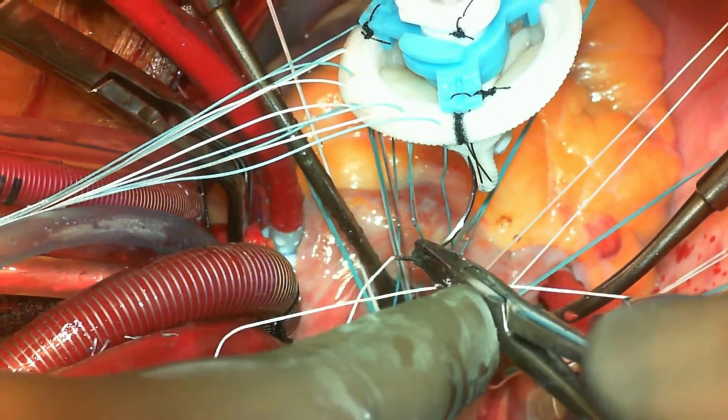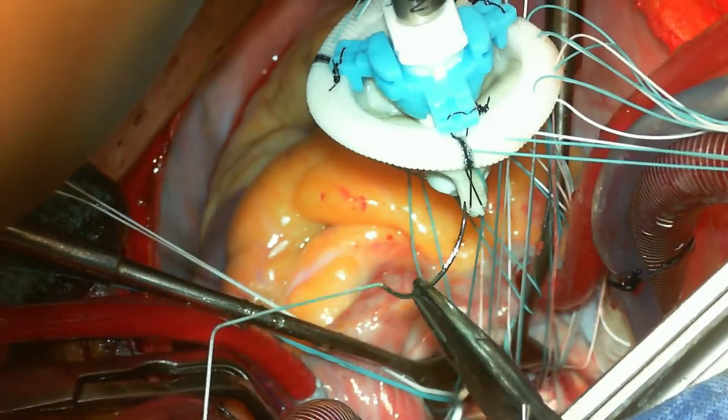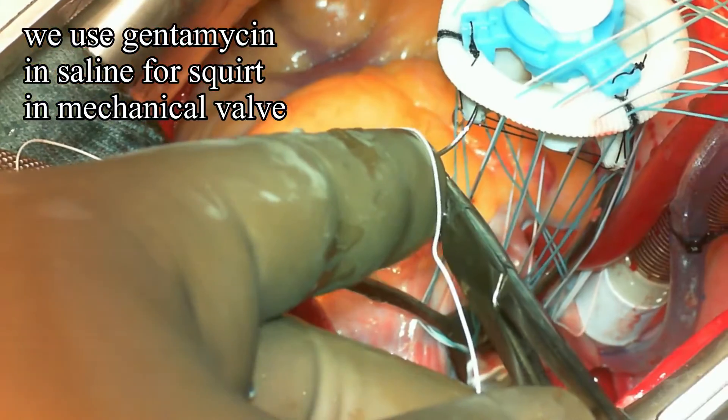Mind you, the needle should not be piercing your glove or touching the skin, and one should not be using antibiotic solution to keep a bioprosthetic valve wet.